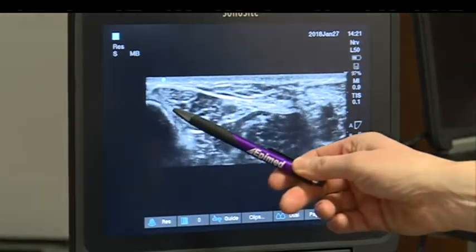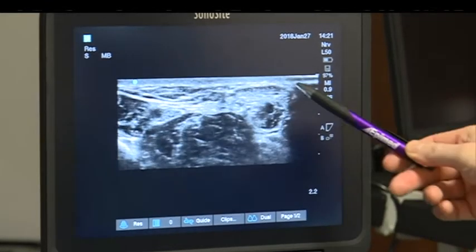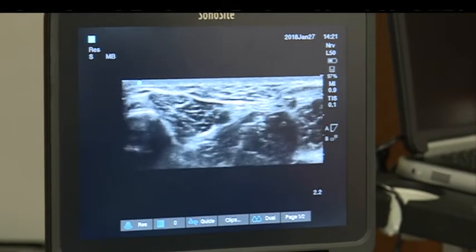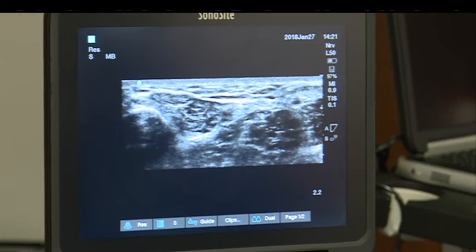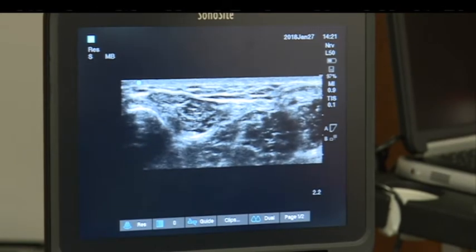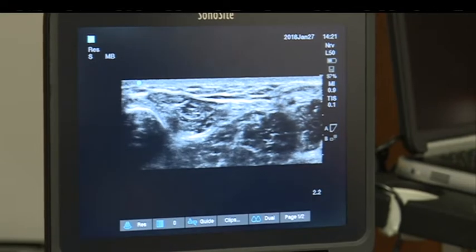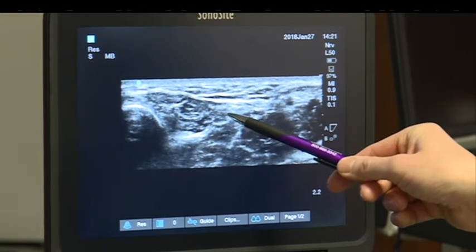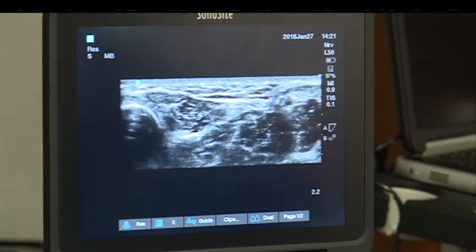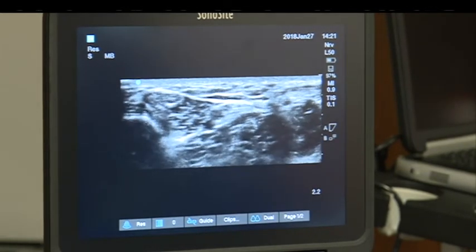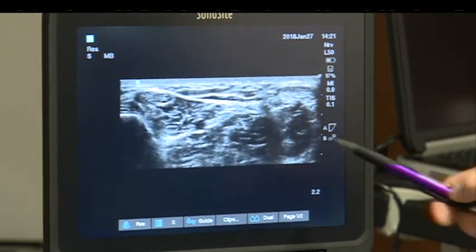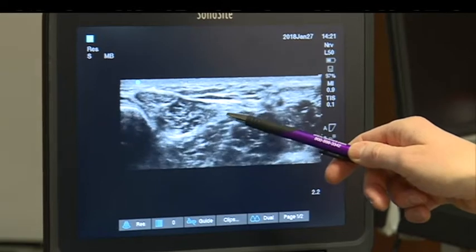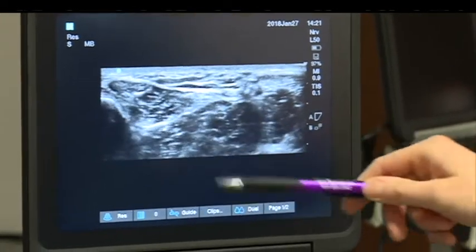The medial malleolus is here, and scanning posteriorly this is the Achilles tendon. We first look for the posterior tibial artery. Hold the probe really still — it's a small artery, so you'll just see probe movement if you're not steady. You can see the posterior tibial artery there, and relaxing pressure a little reveals a couple of veins, one either side — very characteristic anatomy.